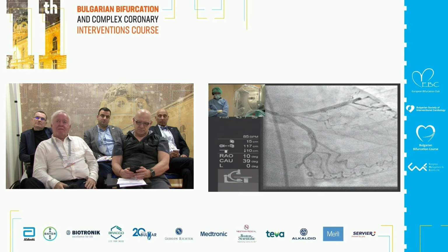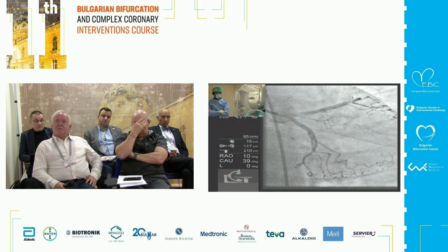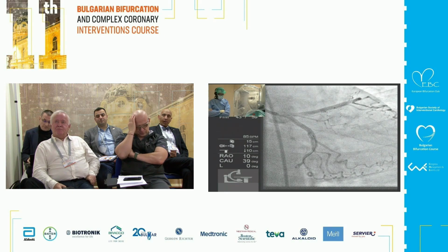That's fine. What I'm trying to understand is the following, because what you said for the long term, a very important thing is the appropriate tapering of the stent conforming to the left main and respecting the diameters of the bifurcation, correct? Absolutely. So you implant a stent which is 3.5, it sits very well to the distal diameter of the LAD, and then you put it up to 5.0, and then you do the kissing.